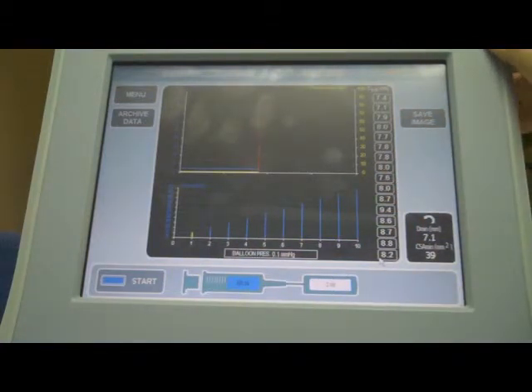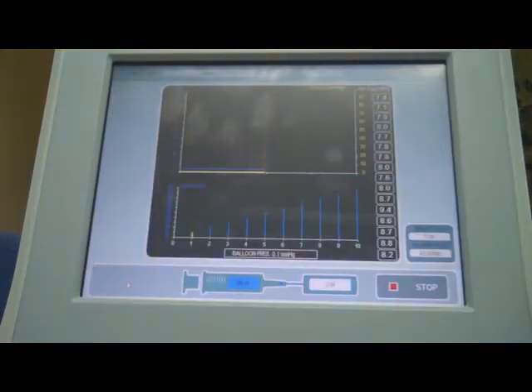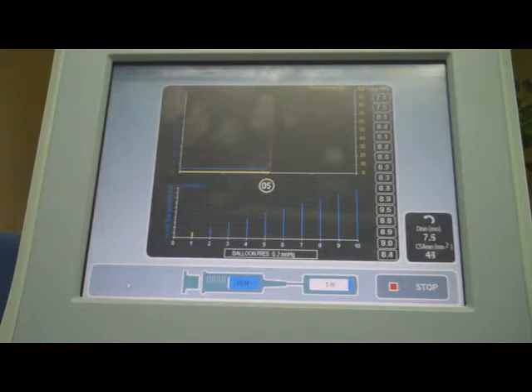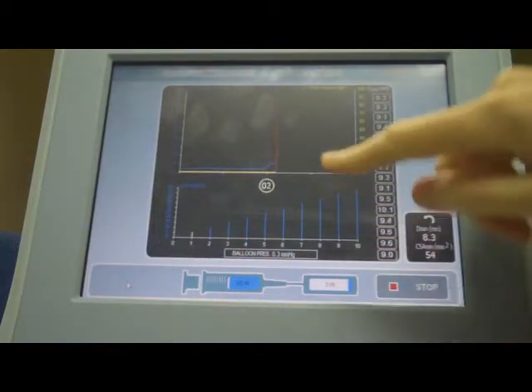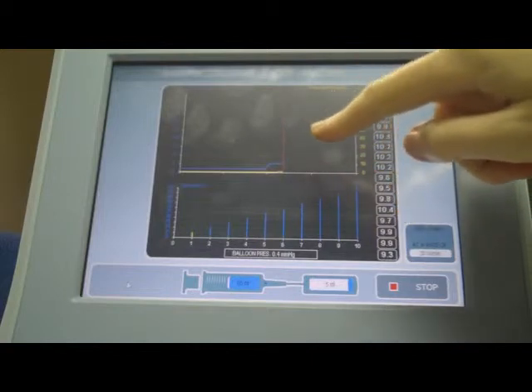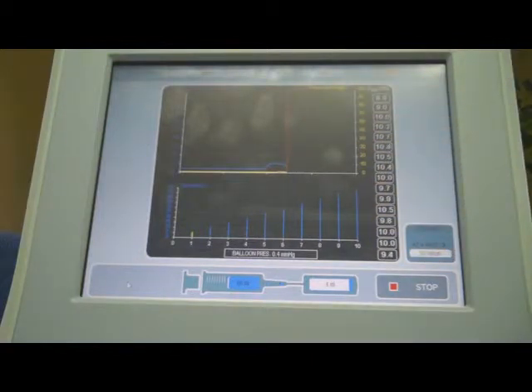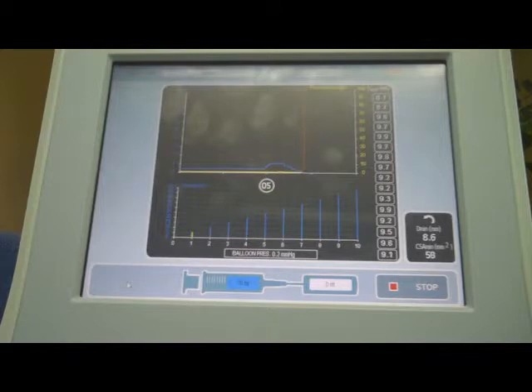To start a procedure, press the start button. It's going to inflate to the target volume of 5 mL, which it has done. It waits for the 5 seconds we configured, then it deflates. Once it deflates, it waits for 5 seconds as configured, before moving on to the next step, which will inflate to 10 mL.